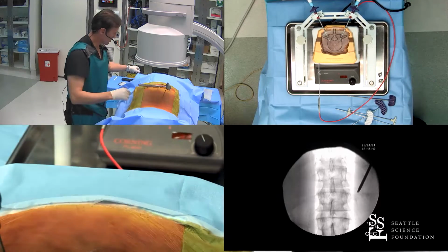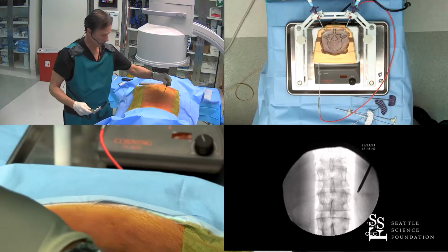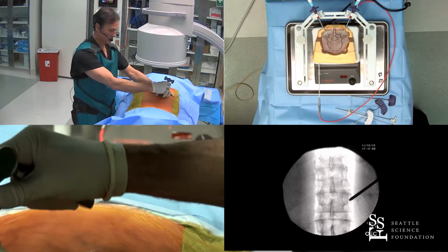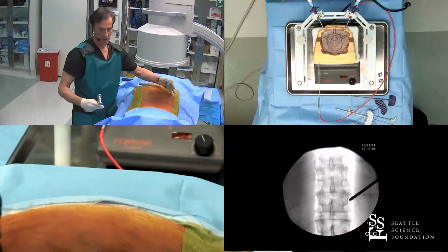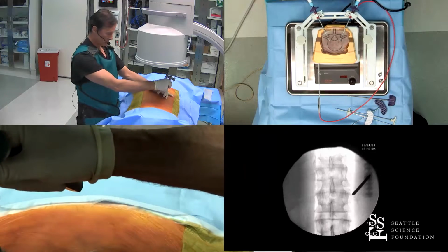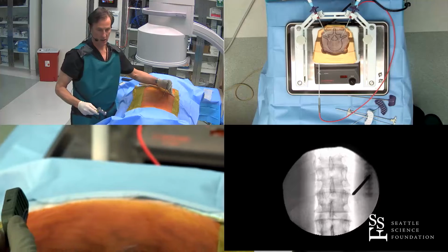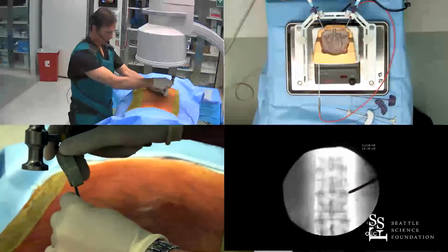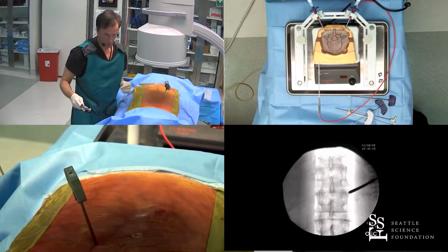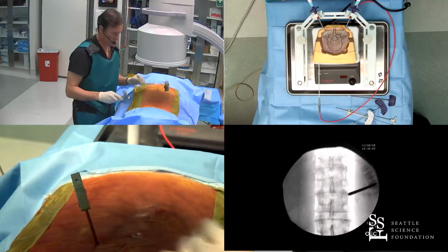And so we always use a mallet for this. For those of you who are not using a mallet for your augmentation, use a mallet, because that's definitely what is necessary. You have better control. And for people that think they have good control without using a mallet, it only takes 1 plunge to make you a believer. So 10 o'clock and 2 o'clock positions, right? This is the 2 o'clock position of the vertebral body, and this is a transpedicular approach. The 10 o'clock approach is on the other side.